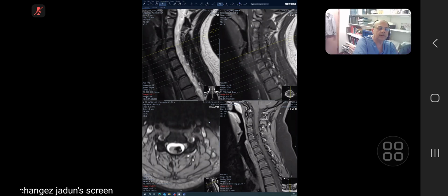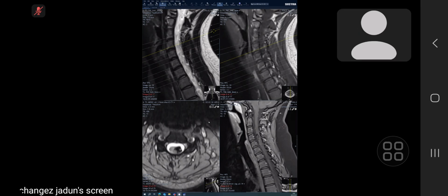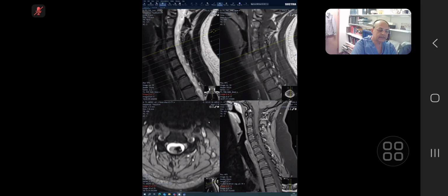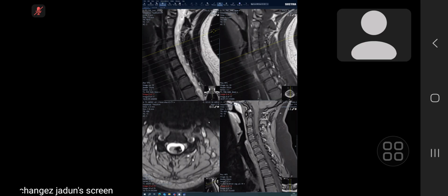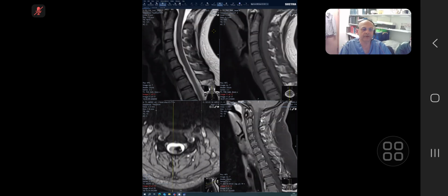How is it a cavernoma? You have said extramedullary intradural. It won't be in thin air. It has to be in a parenchyma. But it doesn't fit into any of the extramedullary intradural tumors as well. So, okay, let me wrap it up for you.